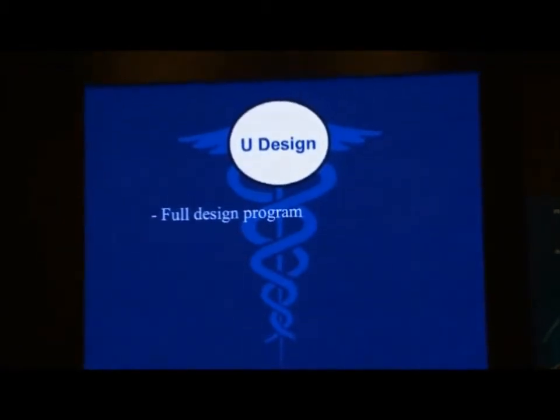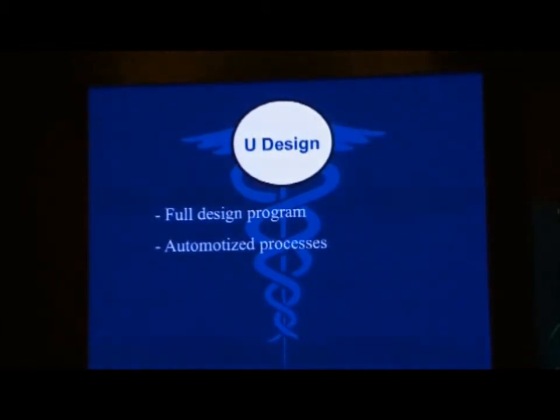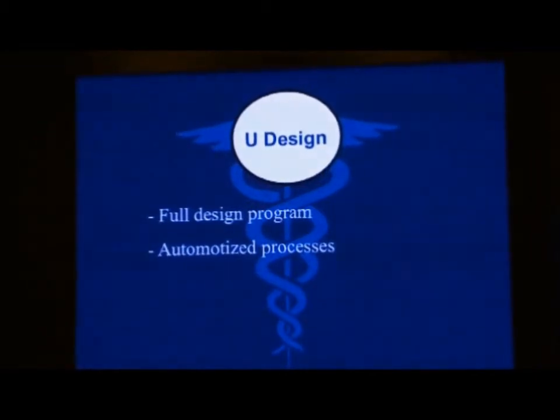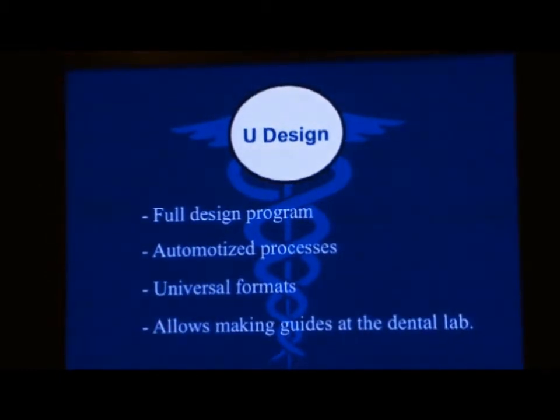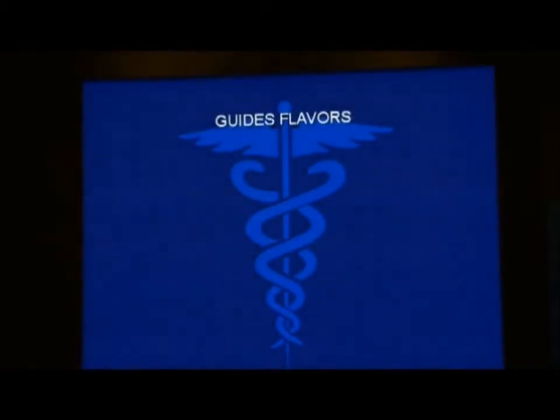We have a program to fully design the guide. It's an automatized process as we need, or we can customize it if we need. It's using universal formats, and it allows making the guide fabricated at the dental lab. This is very important. It's not centralized in one country for all the world. You can go to the dental lab, which is an agreed dental lab next to you, to fabricate your guide.